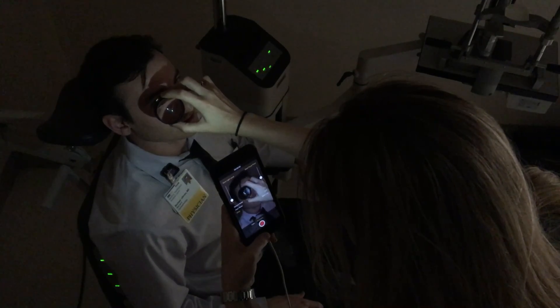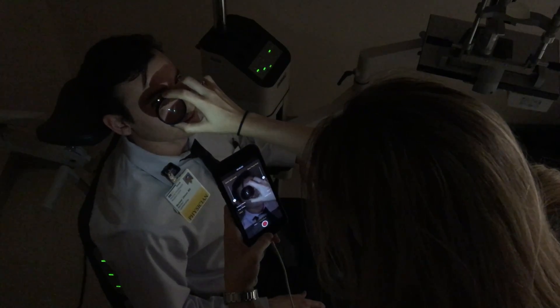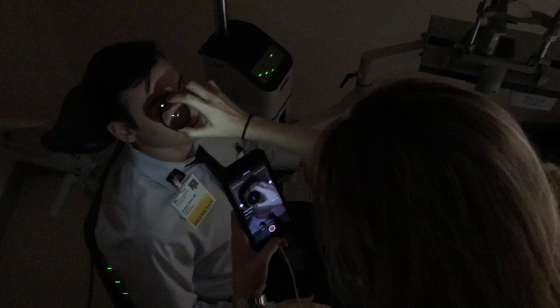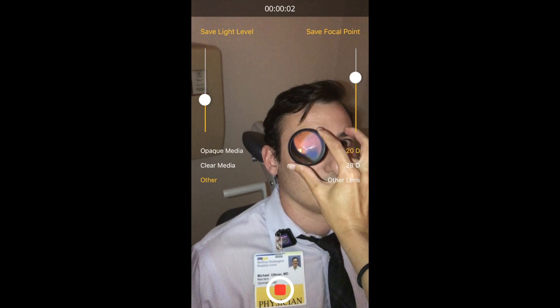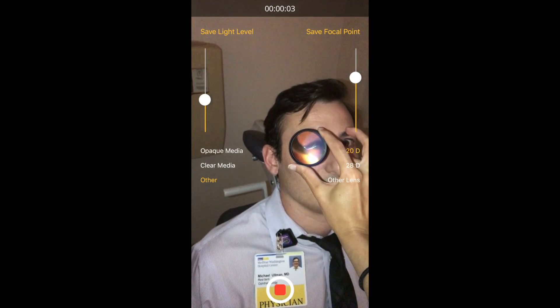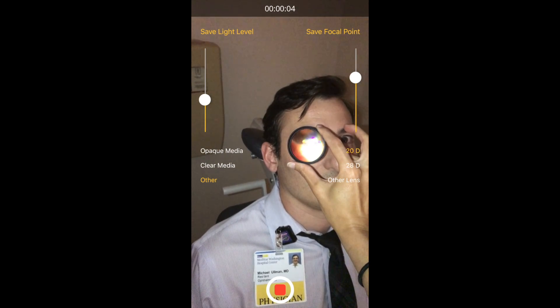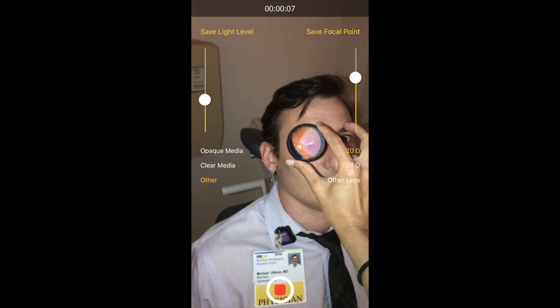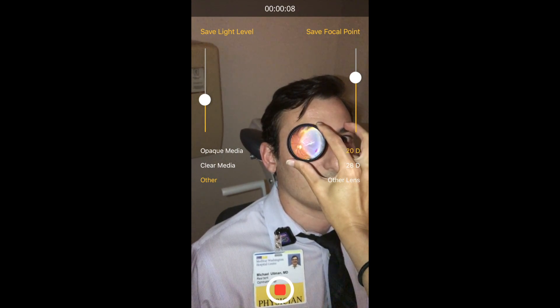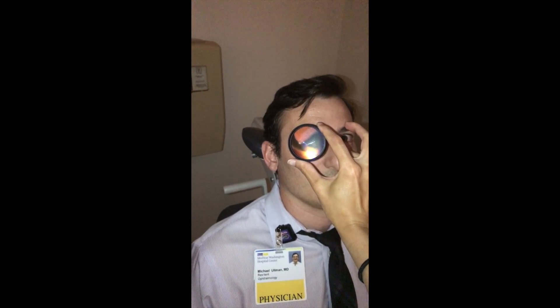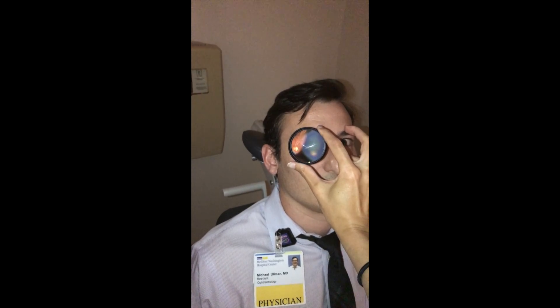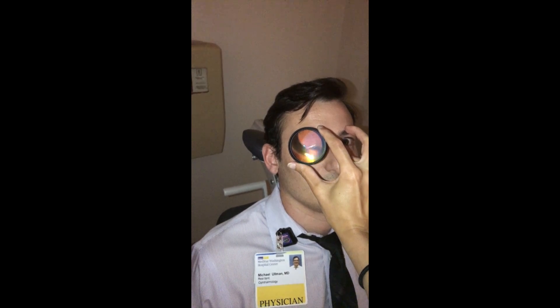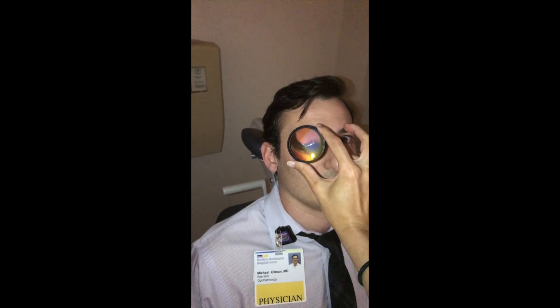Here is a video of the exam being done with the Ullman indirect. Just like the photo burst mode, your final product is saved to the camera roll. Please leave your feedback in the comments, and download the application in the app store and leave a review — it's free to download.